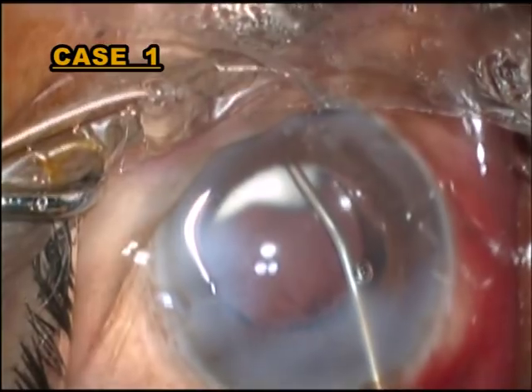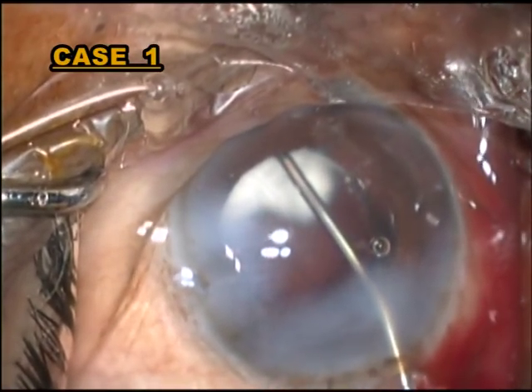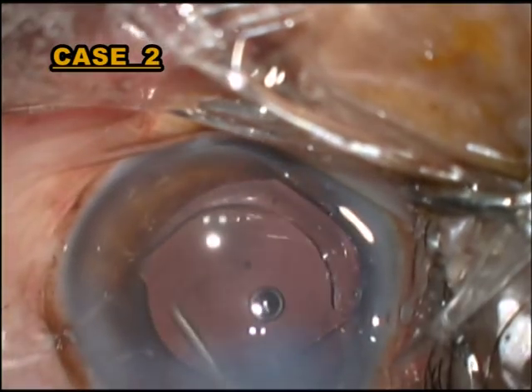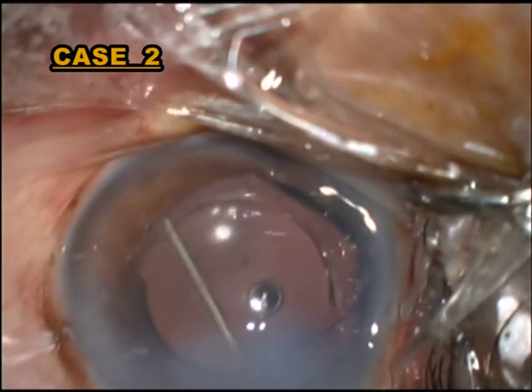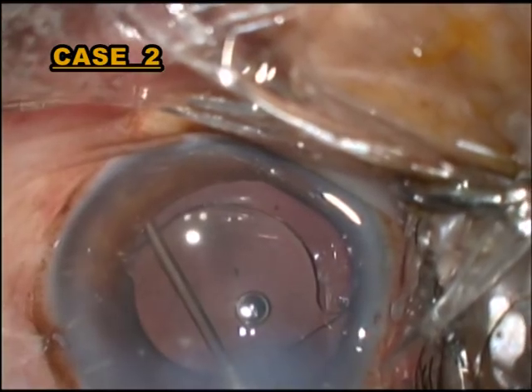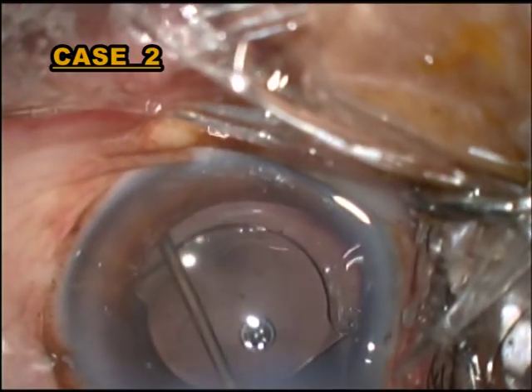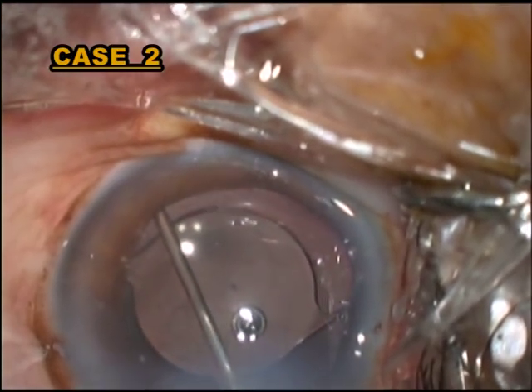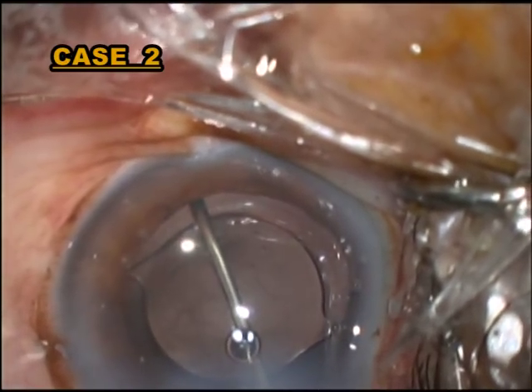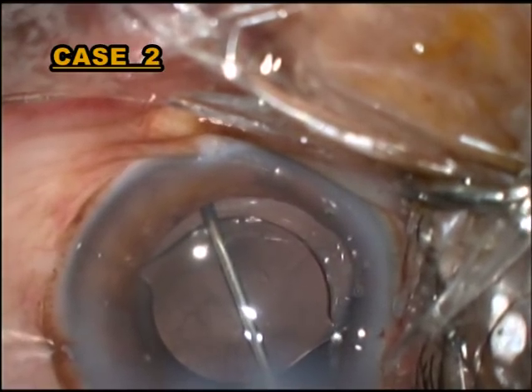After completion of the lens implantation, a certain amount of viscoelastic is injected into the sulcus between the iris and the lens capsule to widen the sulcus area. Then with a 27-gauge cannula, we introduce it into the trans-zonular space and inject into the vitreous cavity.